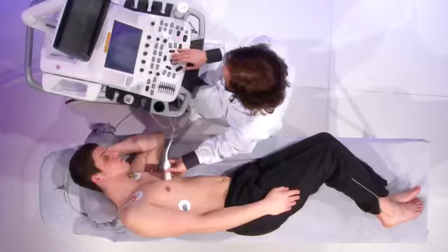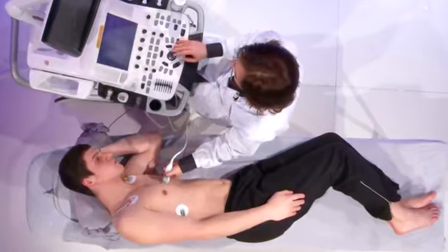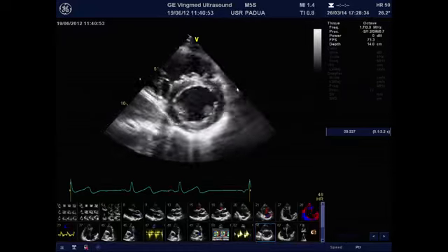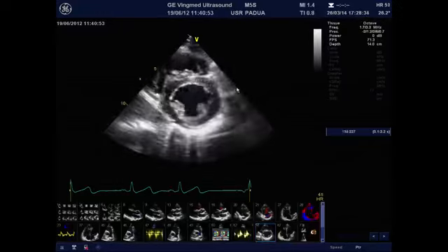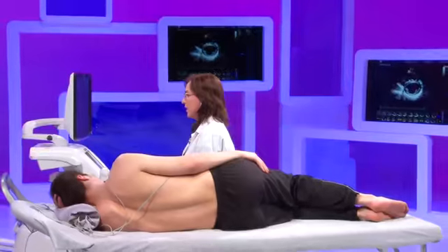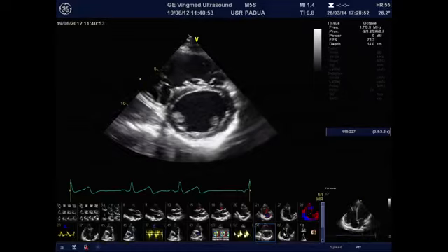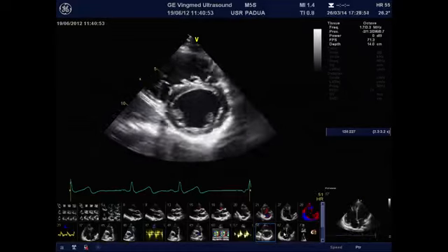Now let's take a close look at the right chambers and on the consequences of this volume overload on the right heart. If I see from this position the short axis view, I can appreciate the motion of the septum and the septal flattening in diastole, which is indicative of the volume overload and also of the interdependence that is related to the high pressure in the right ventricle, which impacts on the septum and produces a diastolic dysfunction on the left side.